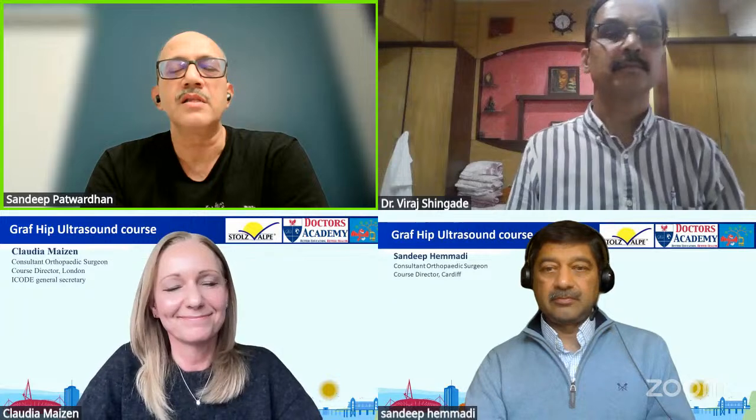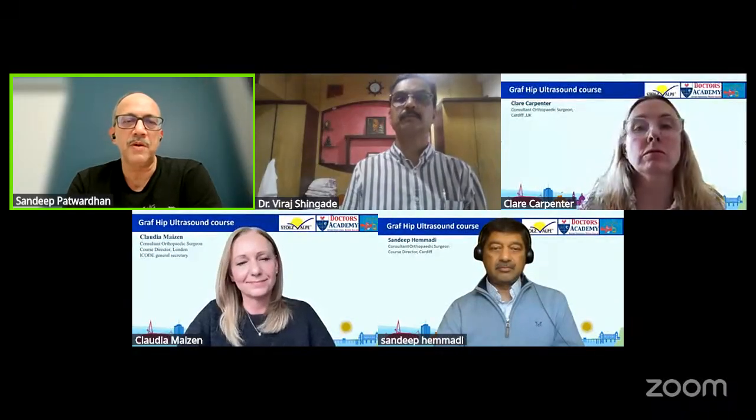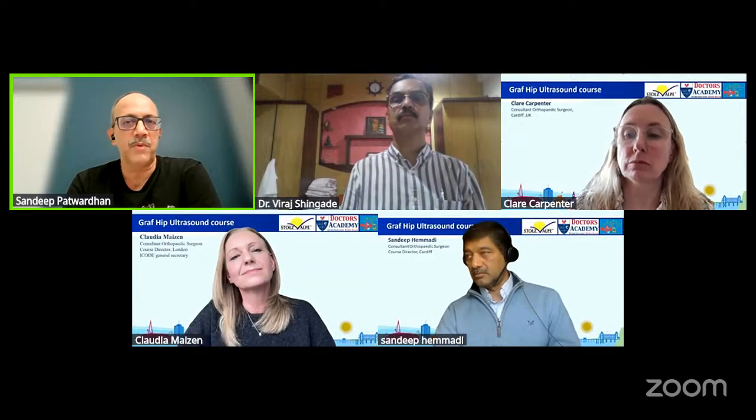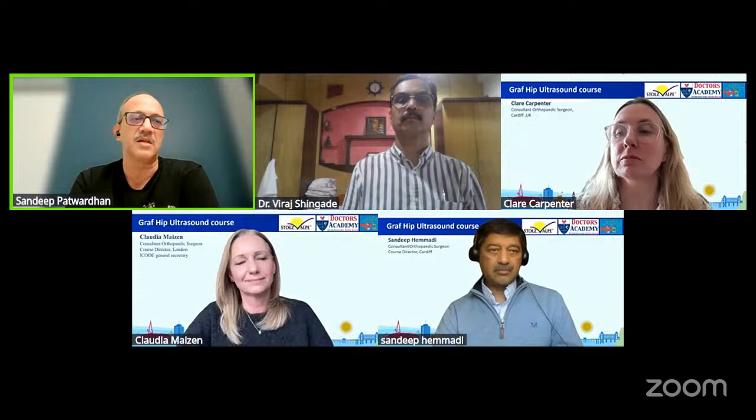That was really a lot of information. And as you said, unless you do the practicals, it's really difficult to understand the type 2C and the D hips. But for the general people who are attending this for the first time, what can we say as a generalization? That if your bony roof angles are above 60, you're probably safe. Absolutely. Because if they are looking at a simple report given by somebody, the pediatric orthopedic surgeon should be reasonably confident that the hip is well developed and stable if the alpha angle is above 60.